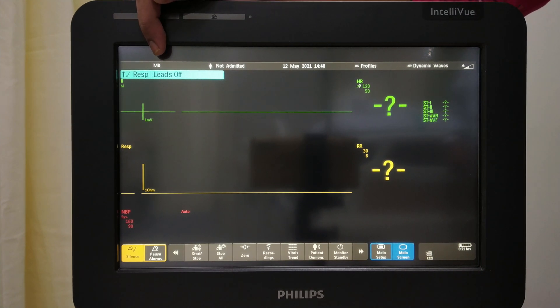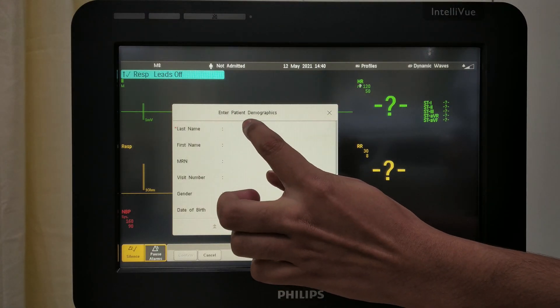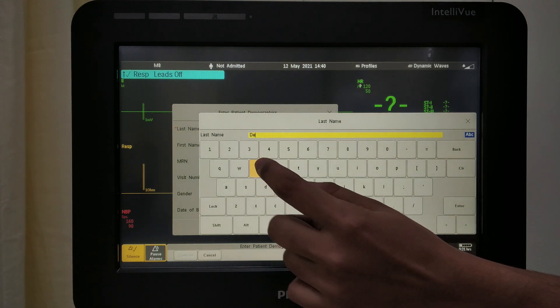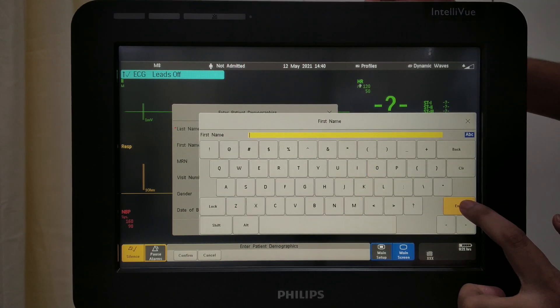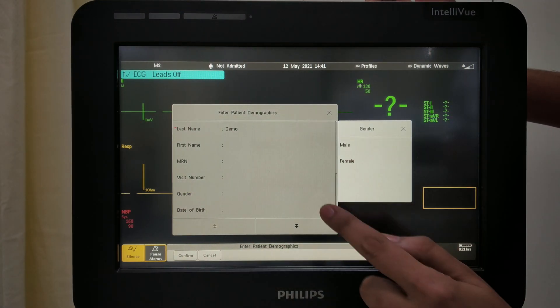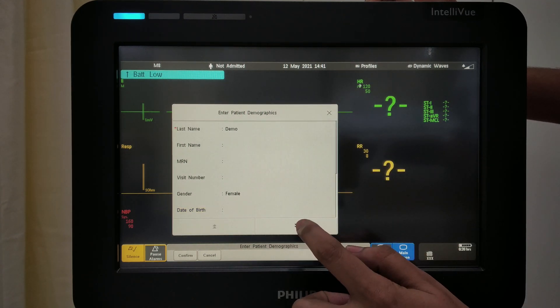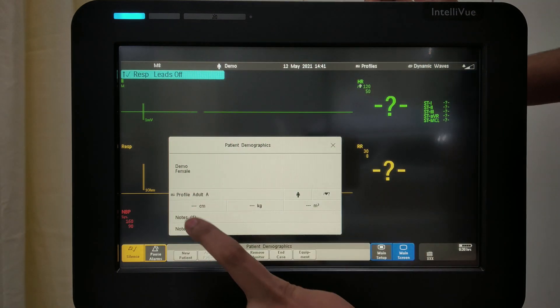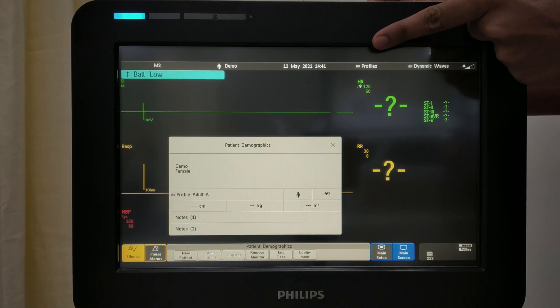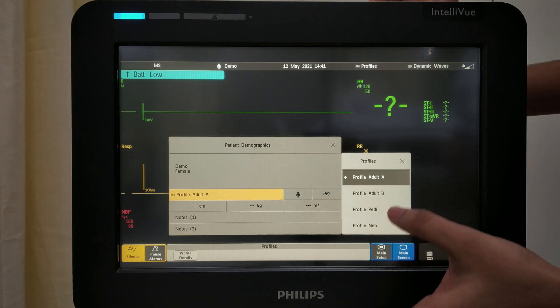Starting with the top area, here you can see the bed label. Here you can admit your patient and enter the details — first name, MRN number of the patient. Once the details are entered, confirm. Your patient name and all details will appear here. You can select the profile from here as well — the category of patient: Adult, Paediatric, or Neonate. Accordingly, you can select.